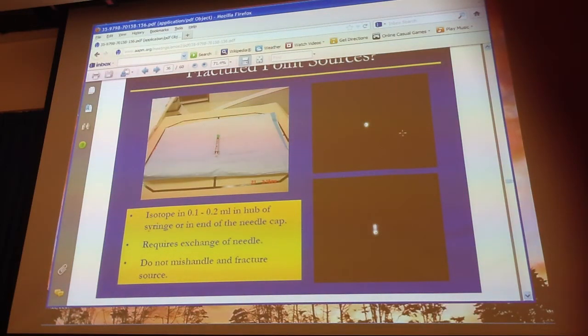No, it's not diverging. The pulse height analyzer is broken on that one, where it's making it look like it's coming from 2 different areas when it should be superimposed. Okay, now, so would that be the pulse height analyzer? This is what Monica said, and she's on the right track. She's saying that the pulse height analyzer is broken, and that's why we get 2 dots there. Ashley, what would be your interpretation of this?